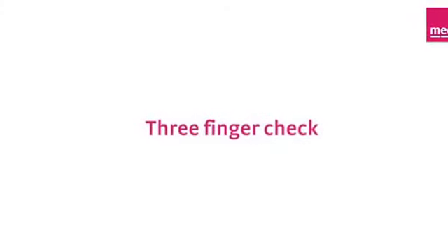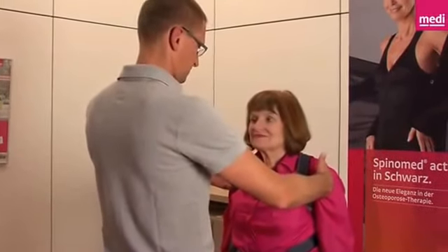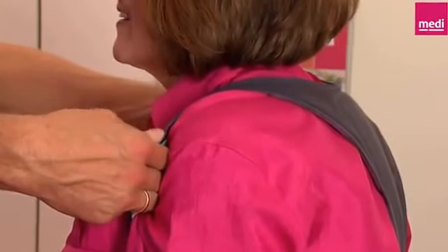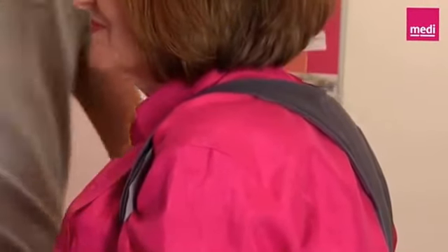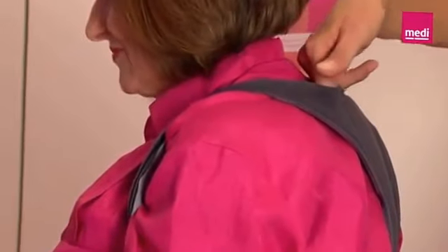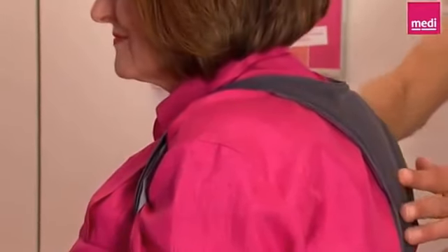Three finger check. To avoid constrictions, check that the brace is correctly adjusted by seeing whether you can slide three fingers between the shoulder strap and the shoulder of the patient. Secondly, use three fingers to check the distance between the neck and the upper edge of the brace — this ensures that the patient has enough room to straighten up while wearing the brace.